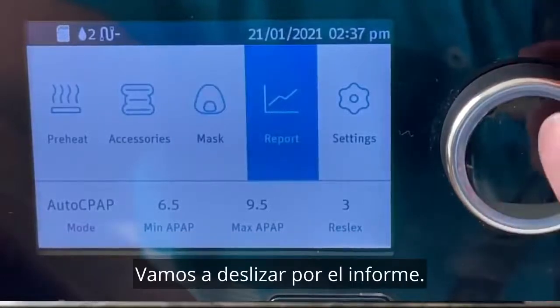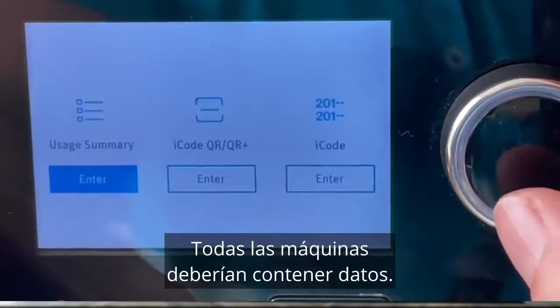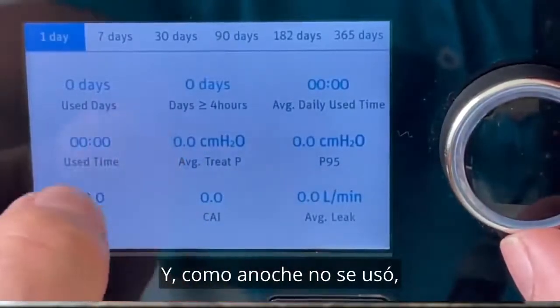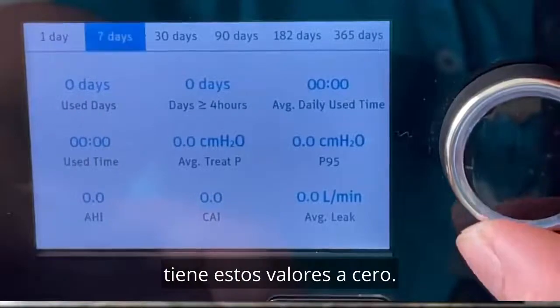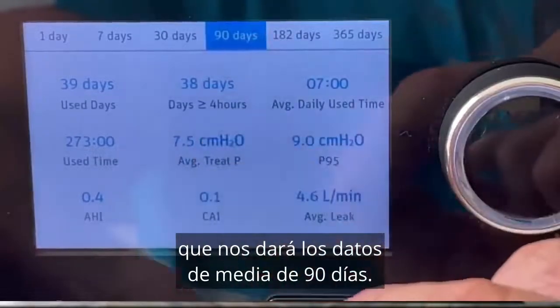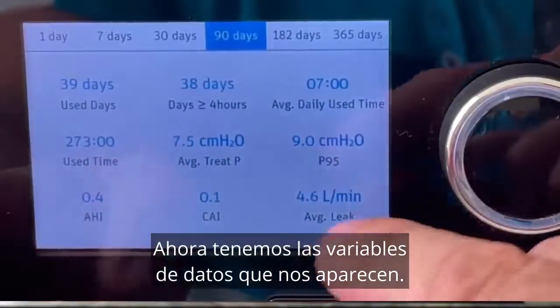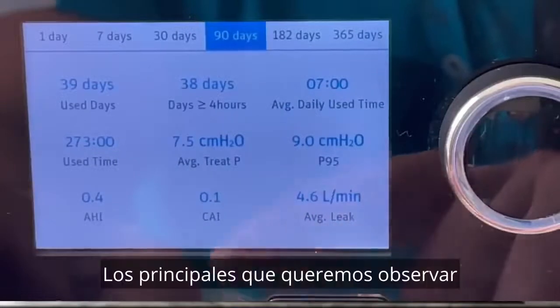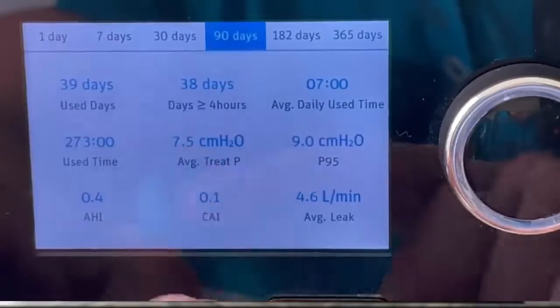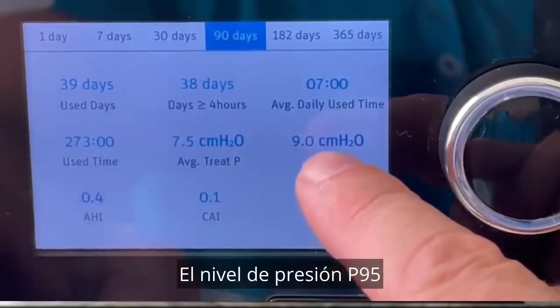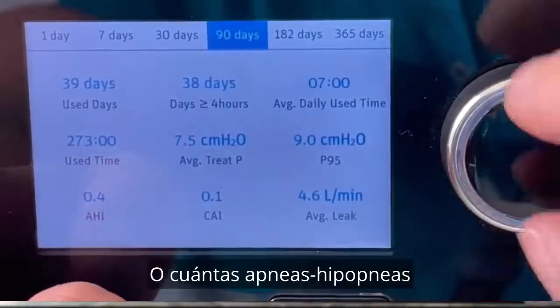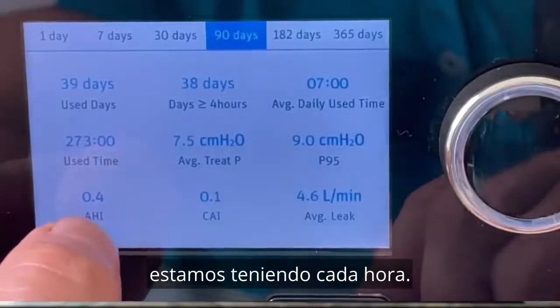Let's scroll across to Report. All machines should have some sort of data on them. Because it wasn't used last night, all these values are at zero, so I'm going to scroll across to the 90-day average, which gives us 90 days of average data. The main variables we want to look at are our average pressure, our P95 pressure level, and our apnea hypopnea index — how many apneas and hypopneas we're having on an hourly basis.